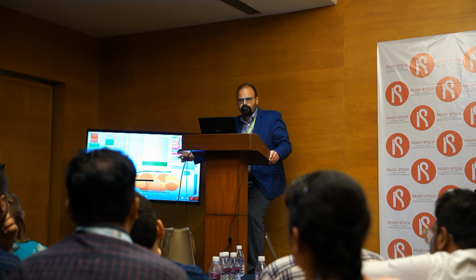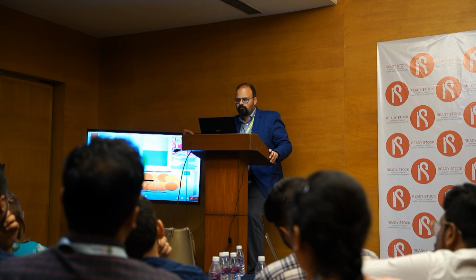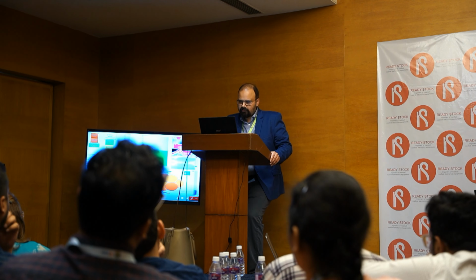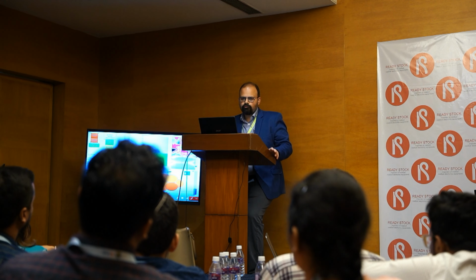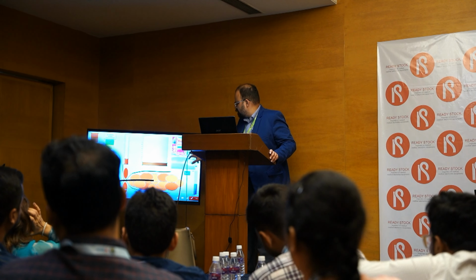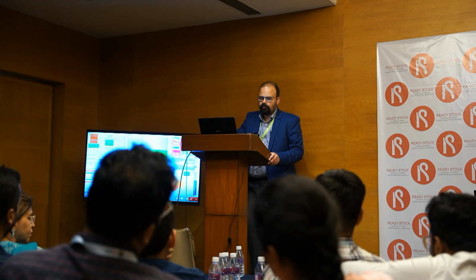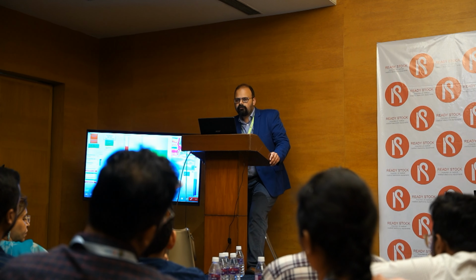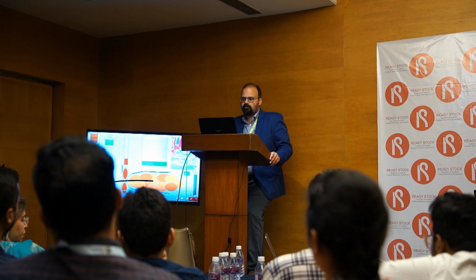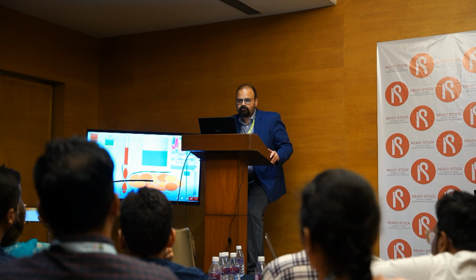This is the same one I showed you the manometry of originally. In the first recording that I showed you, he had dyssynergia. So he went for biofeedback, and now around the 5th session he is able to have a good rectal push, and he is able to relax his canal well while he is pushing down. As you can see here, the canal is relaxing well when he is pushing. So this is somewhere around the 5th or 6th session. At this point, when I do a BET, if he is able to pass in 30 or 40 seconds, then I will give him that Foley's and a glove, and I say, okay, now you can be at home. I will call him back after 3 months.